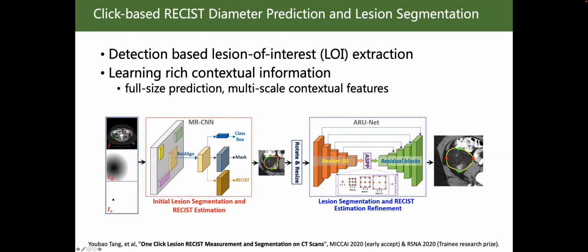As shown in the left image, extending the Mask RCNN, the proposed MRCN outputs the RECIST estimation results in parallel by adding a new branch for predicting the heat maps of the 4 key points, which are the 4 endpoints of the RECIST diameters.